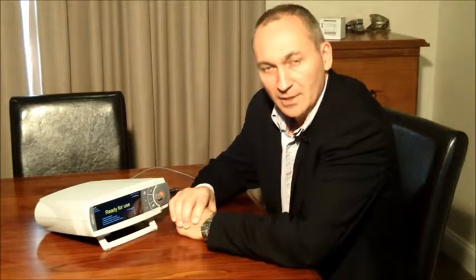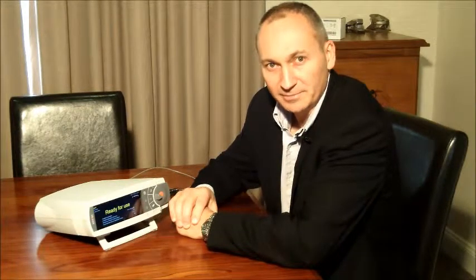Hi, I'm Tim Gresham from Temple Health Care. This is another instructional video for the CENTEC transcutaneous CO2 and O2 monitor. In this video we're going to show you how to put the probe on a patient, make a measurement for as long as you desire, and then take the probe off the patient.